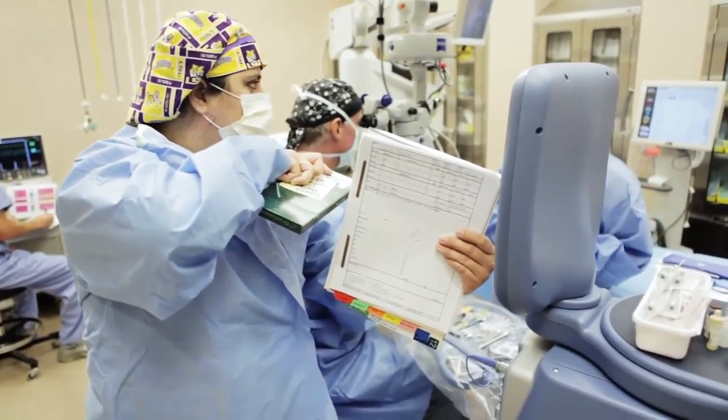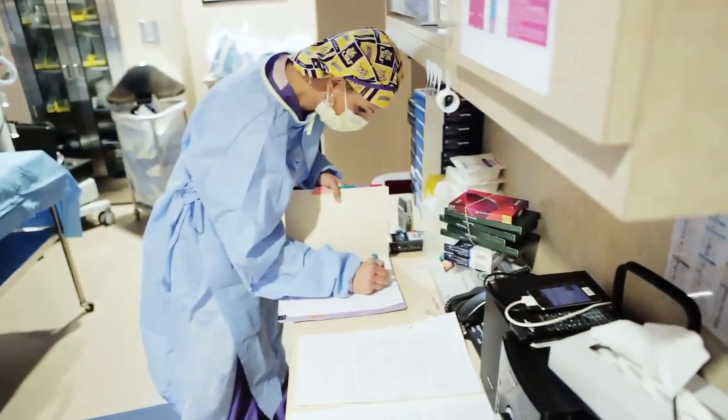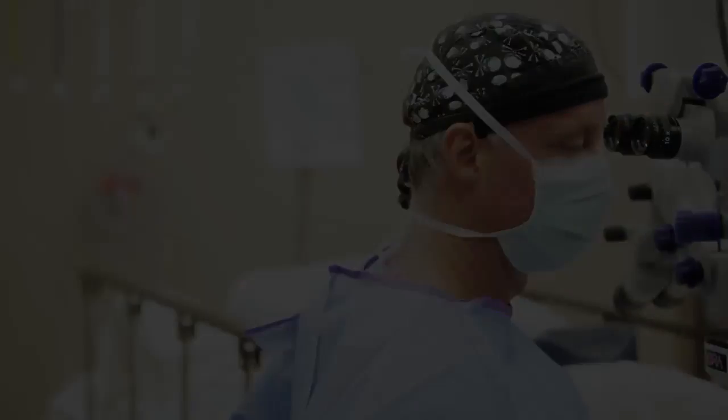That power implant dictates how sharp your vision will be without glasses or contact lenses after surgery. So I want you to look at this flashing red light for me now.